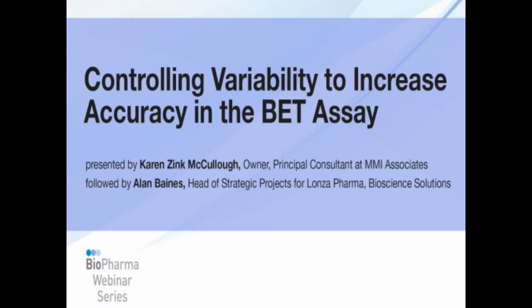I am Karen McCullough, the owner and principal consultant at MMI Associates. I'm going to take a few minutes today to talk about accuracy in the BET assay. As you know, the bacterial endotoxin assay has quite a large acknowledged error, depending on who you talk to, certainly a plus or minus a twofold dilution. And for those who are analytical chemists, that's just huge.